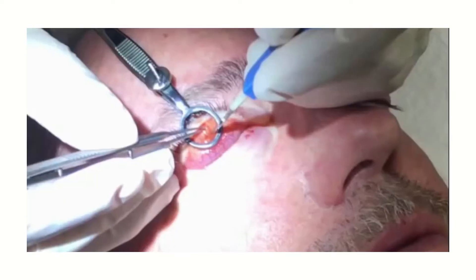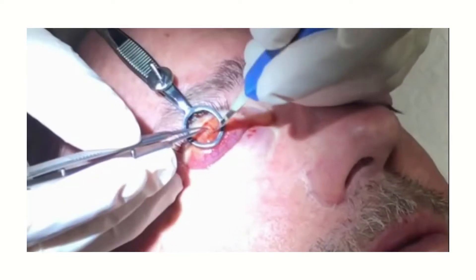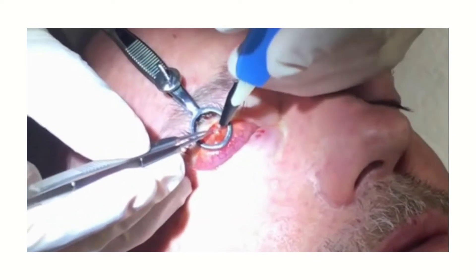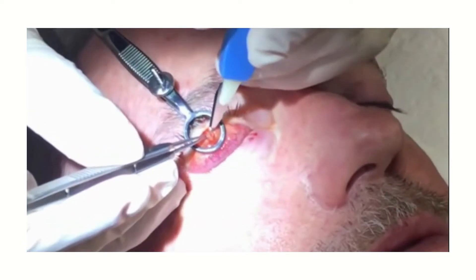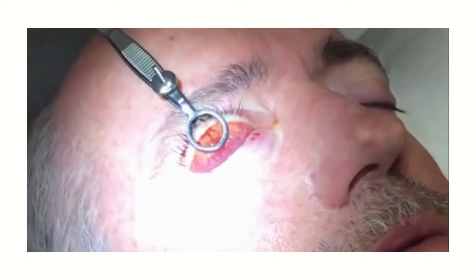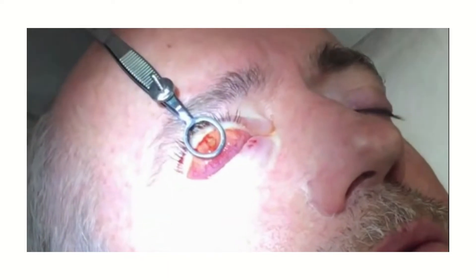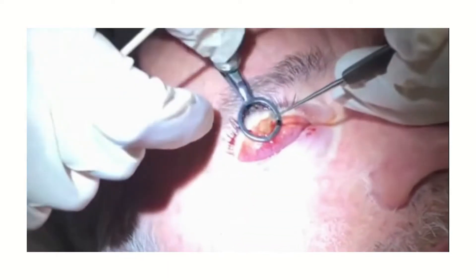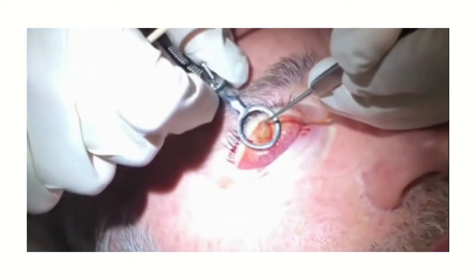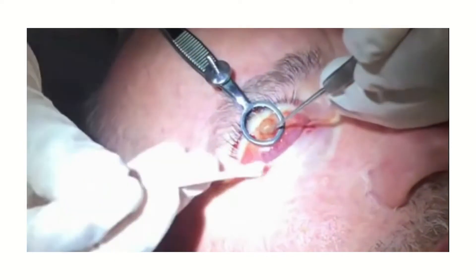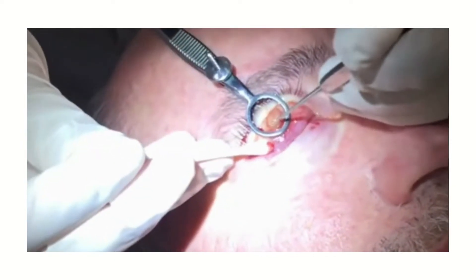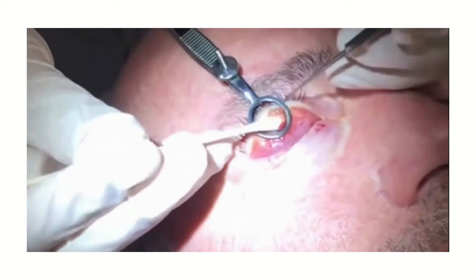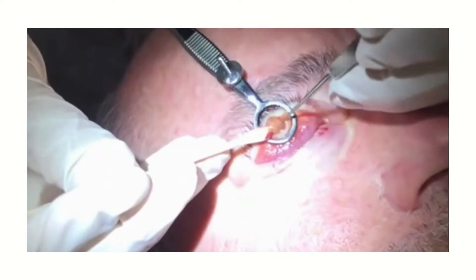The chalazion clamp is applied to the everted eyelid. The clamp is tightened and used to evert and expose the conjunctival aspect of the eyelid. The clamp controls bleeding during the procedure and helps in localization of the lesion. It also prevents hematoma formation and accidental damage to the eyeball.